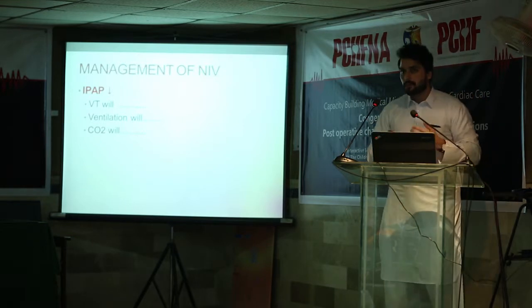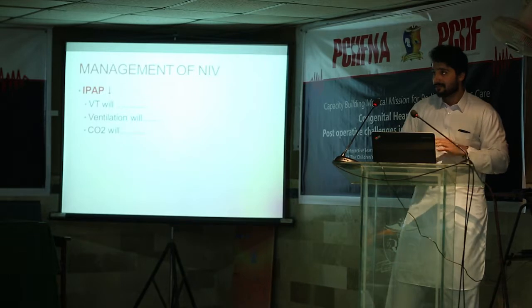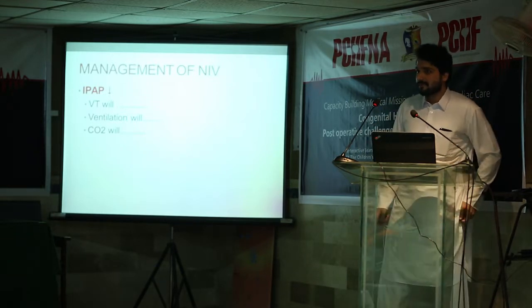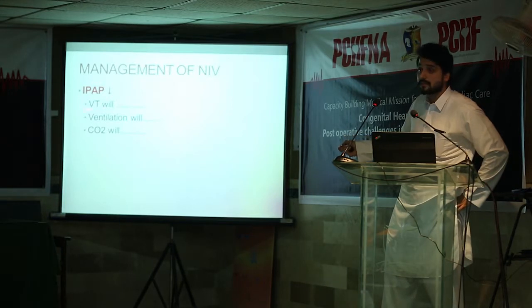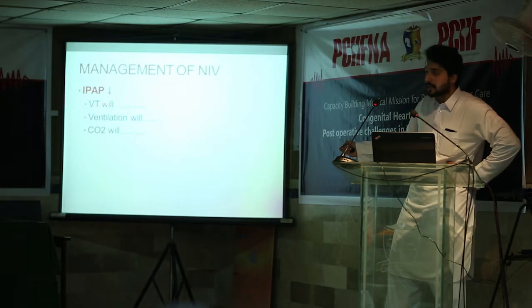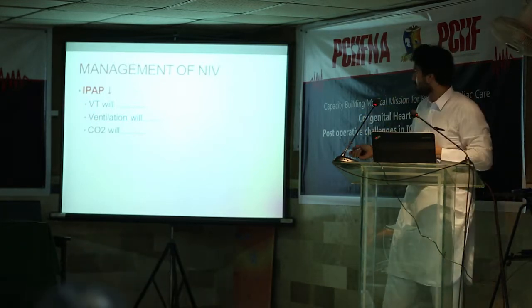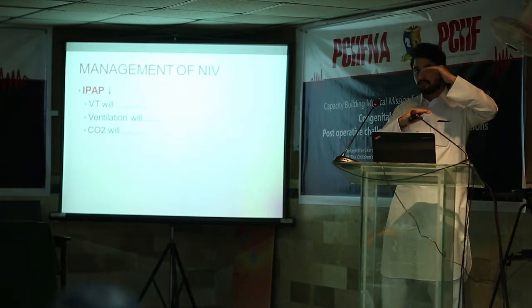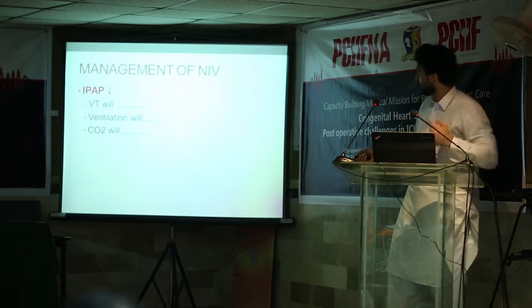So now, this is a question I want to ask our audience, since they were very focused on the presentation, okay? If the IPAP is dropped, what do you think will happen? You know, the EPAP is there, IPAP is there. IPAP is dropped. What is going to happen to your tidal volume? It will decrease. Good. What will happen to your ventilation? It will also drop. And what will happen to your CO2? It will increase. Exactly.